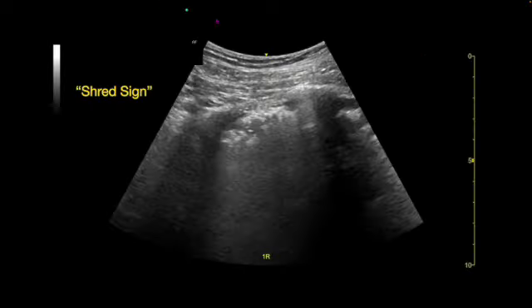This patient has pneumonia. Remember, B lines indicate there's a wet lung in that area, but it's not going to tell you whether it's cardiogenic edema, whether it is a transudate or exudate. In this clinical context, our point of care ultrasound is pointing towards a pneumonia. Now, let it be known that pneumonia can take on various appearances when it comes to ultrasound. You can have focal B-lines like we saw on our previous slide. You could also have something that looks like this.